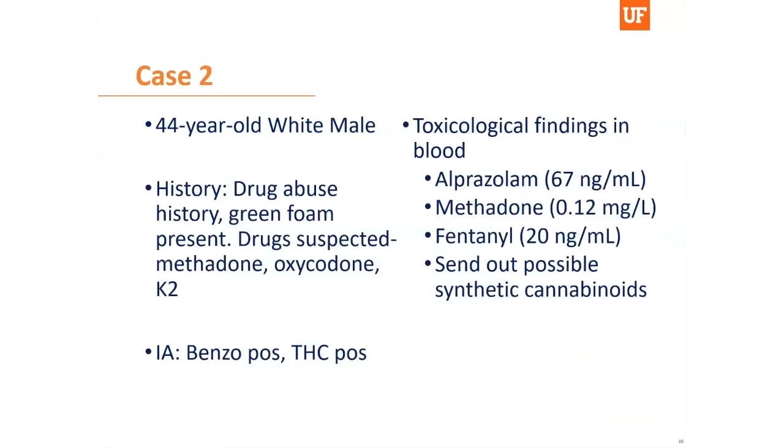Our next case involves a 44-year-old white male. The decedent had a history of drug abuse and green foam was present. The medical examiner indicated that drugs they suspected were methadone, oxycodone, and K2. Our immunoassay results were benzodiazepine and THC positive.